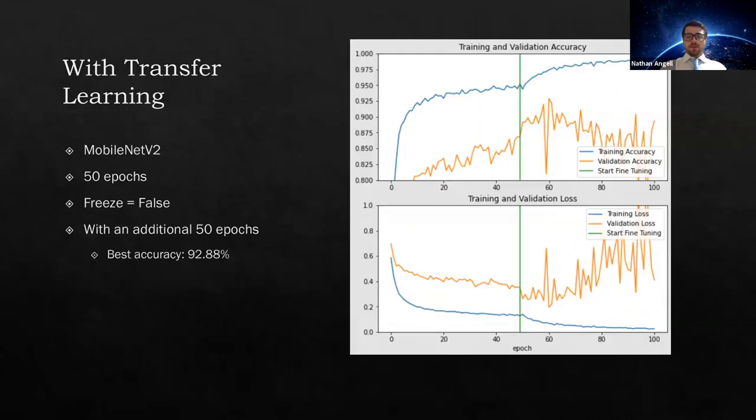So if you look at the orange line running through the MobileNet V2, the MobileNet V2 transfer learning model gave the model better accuracy. As the model passes through the green line, you can see that the model gets more accurate. This is because we set the freeze equal to false.